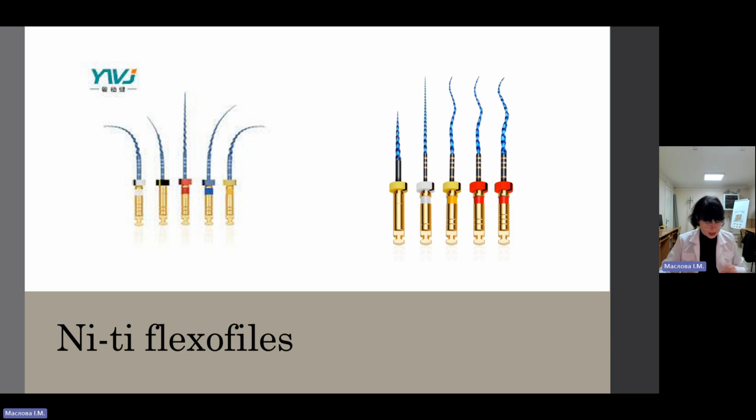A double-ended endodontic explorer, which offers two angles of probing, is then used to locate the orifices of the root canals on the floor of the pulp chamber. The use of the explorer will also indicate whether the access cavity is adequate or whether, as is often the case, a cavity wall has to be trimmed more or a cusp cut to improve the access to the canals.